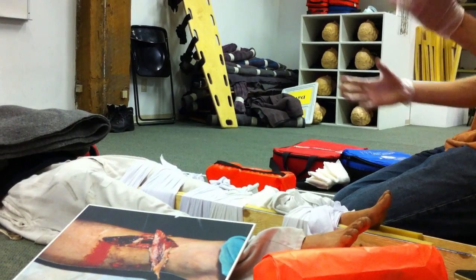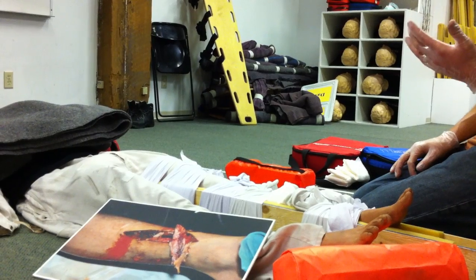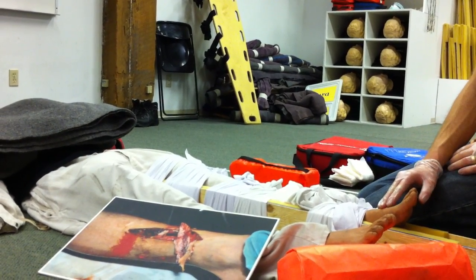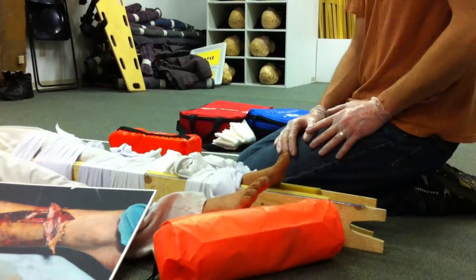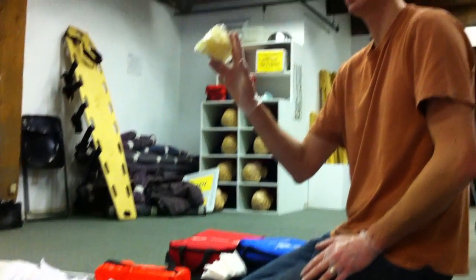So now I've got the splint tied on. Now my job is to make sure that I didn't mess anything up when I put it on. So now the pulse is still present, doing a comparison between the two, and keeping track of my times for my ABCs, my vitals, and the ice.